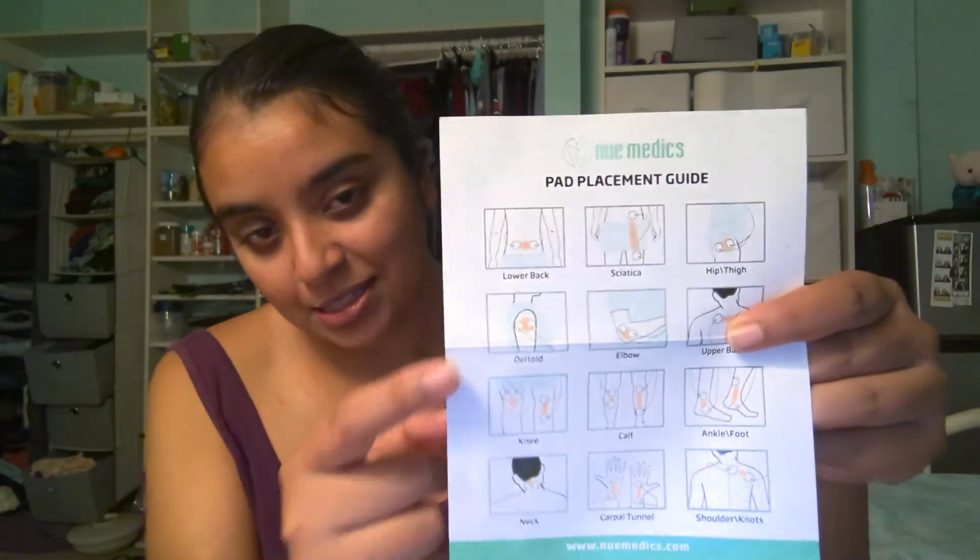So weird. Okay, so what else do you think? I forgot I'm recording. My dad's TENS unit, so when you have the padding and you feel it, you can feel the vibrations from the actual thing, and then it hits the nerves. So this one, when you touch the padding itself, you don't feel it. You feel it in between, which makes this chart make a lot more sense, because I didn't understand why it was shaded. So if you look at the shaded color, that's when you place the pads in those sections, the shaded color is what gets affected. Makes sense now, because when I'm touching it, I feel this tapping sensation.